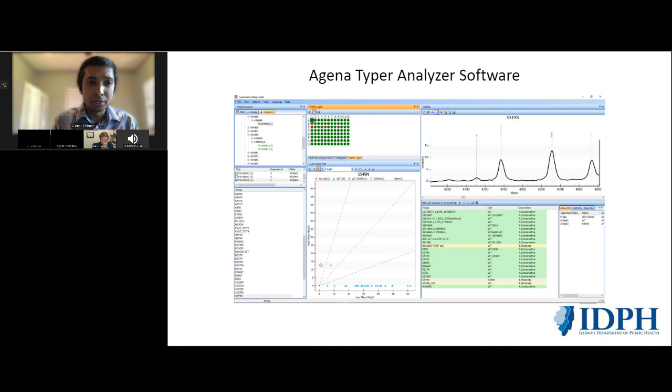There's a field for each of the different assays that you're selecting. This box here contains every single mutation on the panel. This is a snapshot of your 96 well plate, where the different colors indicate how efficient or the quality of the results in a given well, where green typically means that every mutation works. Red means that it's usually a failure or there's no mutations that were actually detected. And then you could have different varying colors from dark green to light green to yellow, which is basically a spectrum of how efficient that specific well on your plate amplified.